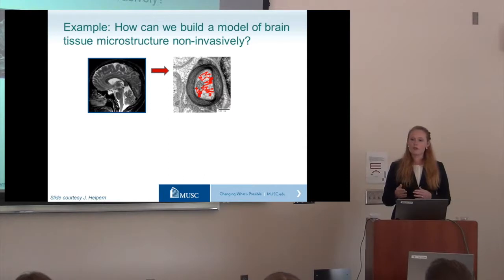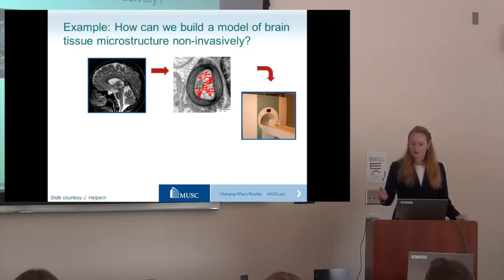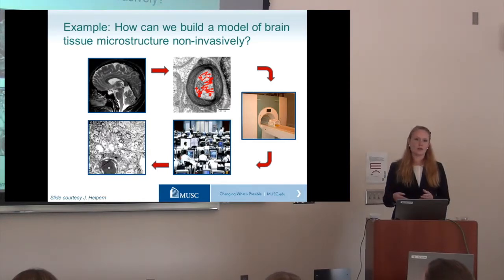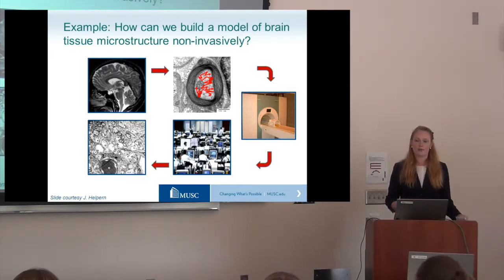What we can do with an MRI machine is make them send out signals about where they are and how fast they're going, and then use some fancy computers to get an idea of what the microstructure looks like without ever doing histology. That's exactly what diffusion MRI provides us.